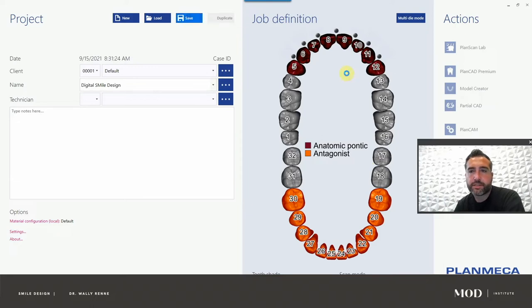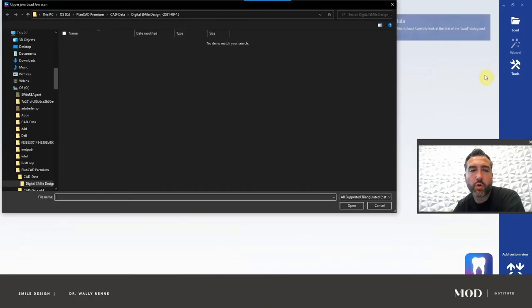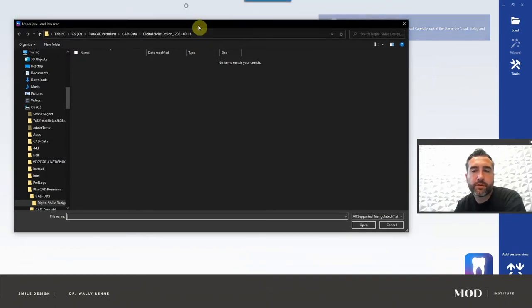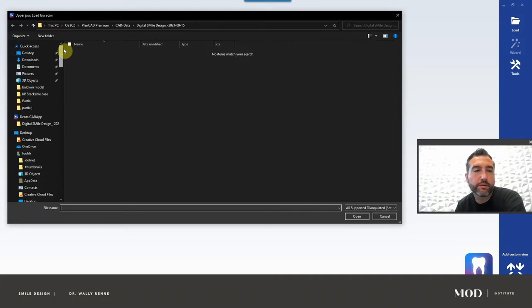We did digital impressions for scan mode. Go ahead and save this and then go to PlanCAD Premium. Download the case from the Mod Institute website so you can play along with me — photos and everything. This is an older case, maybe five years ago, so the photos weren't great. I think that's important to convey about the photography and we'll go into why this is a bad photo group.